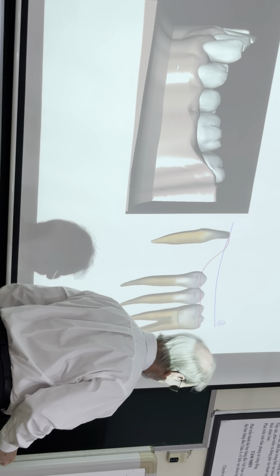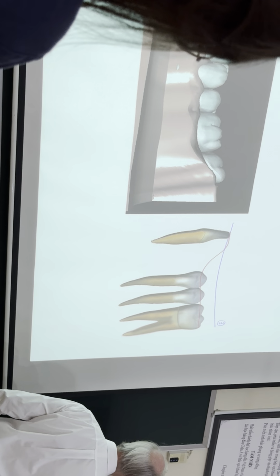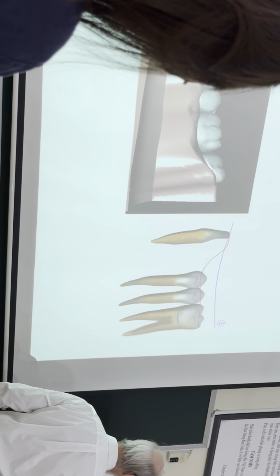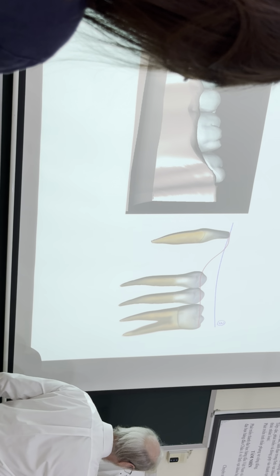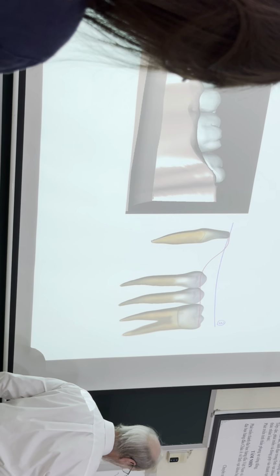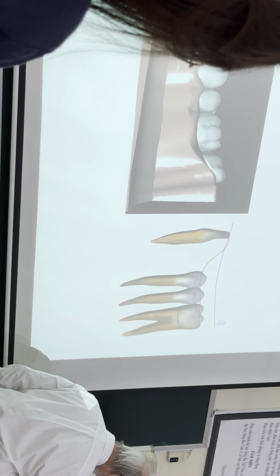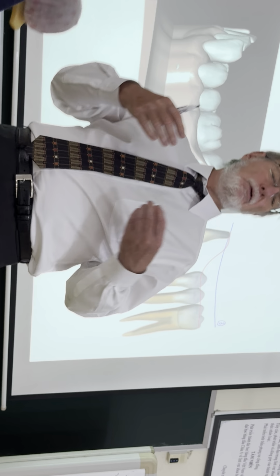Alright, so you have two ways of doing it. You can push with a big force here with an aligner. You push and you push. The tooth will come forward and rotate, so you're going to end up like this. If this is what you want, that's fine. But if you only do that and you don't touch these teeth, you're going to have to procline this tooth a lot. And this is what you see many times, because we only use a force F that is acting on the tip of the incisor. So the incisor comes forward. Yes, the bite is opening, but it's due to flaring, which many times ends up with you not being able to finish the case.